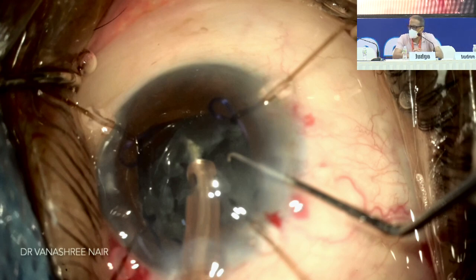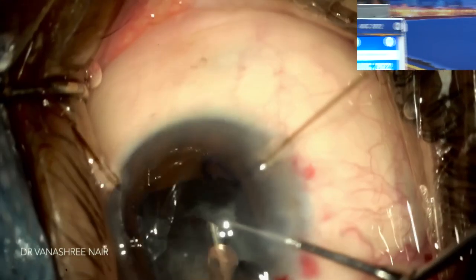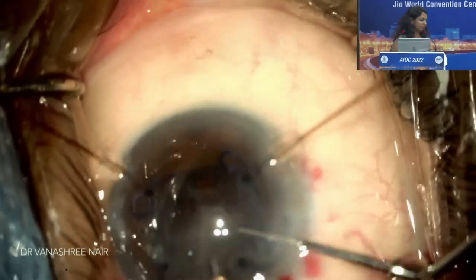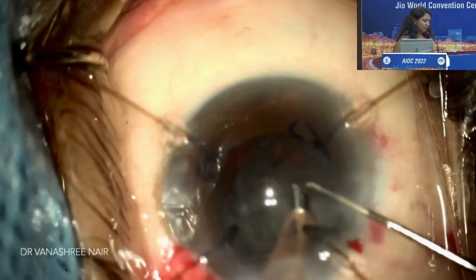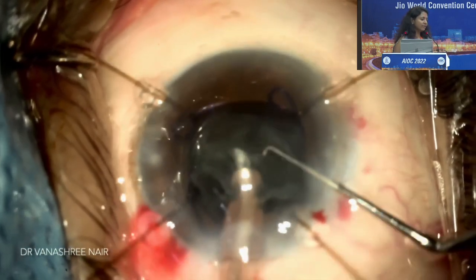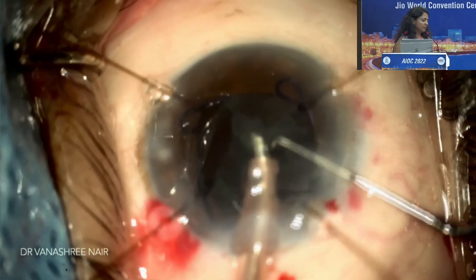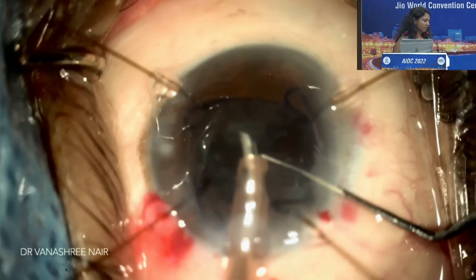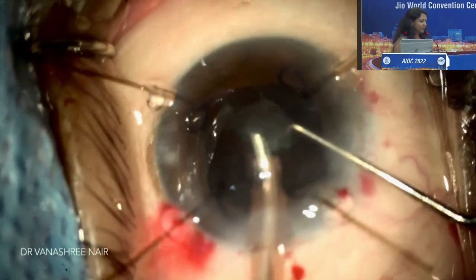Yes, sir. So, moving ahead, I managed to get an edge up actually, and then I ate up the cataract, which is relatively softer. And here again, it had formed a bowl kind of a thing. I was a little afraid that if I use more power or vacuum, I may disturb the capsular bag. Nevertheless, the CTR was in place, so it was a little safer, but still I was afraid that after being so careful, I shouldn't disturb the PC or have a rent over there. So I was being a little more careful.